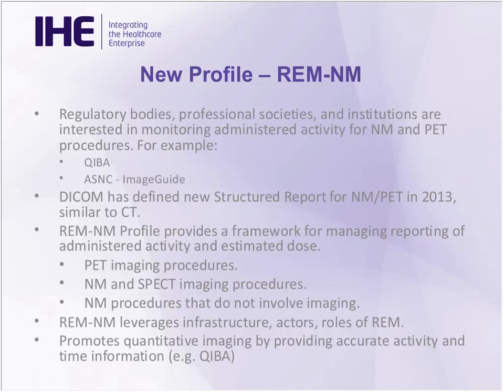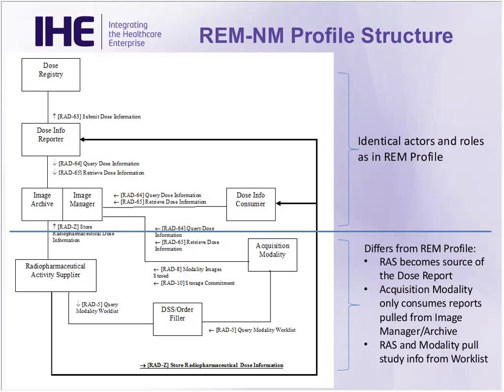This profile also is generally promoting quantitative imaging because it's giving us a way to provide accurate activity and time information throughout the whole imaging and reporting procedure as well. And this is particularly of interest to QIBA, for example. So let me show you, here are the transactions.